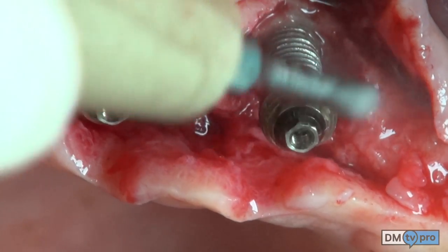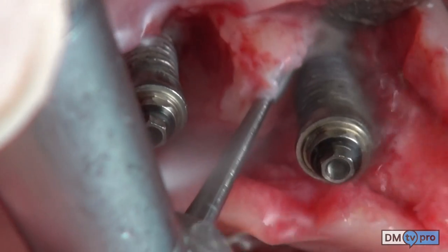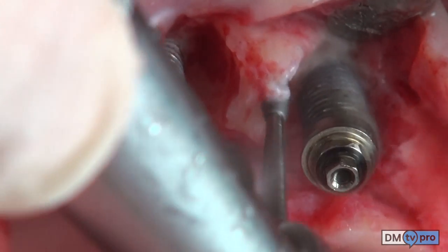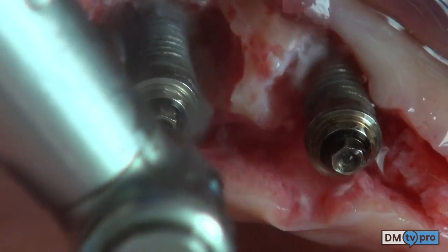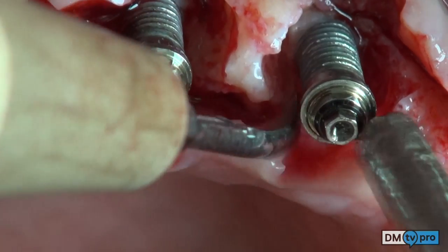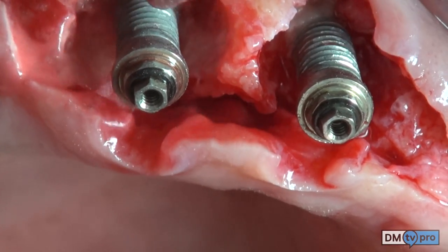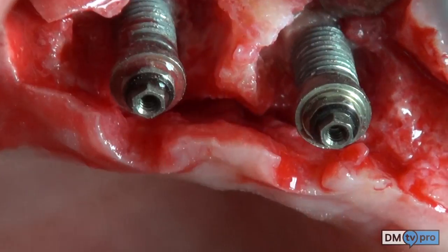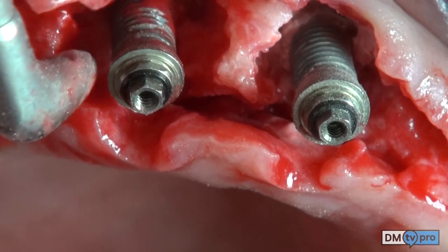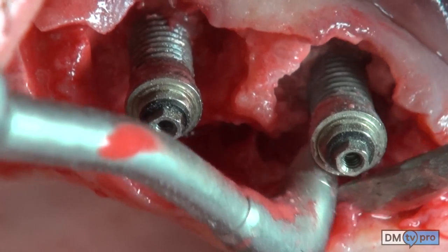The implant surface starts to be cleaned by the ultrasonic handpiece. Then, with a diamond burr on a slow-speed handpiece, a better soft tissue removal from the defect and further instrumentation of the implant surface on top of each thread is achieved. With the airflow device with glycine, the implant surface is cleaned, and inside the space between threads, a metal brush is used to clean the implant surface.